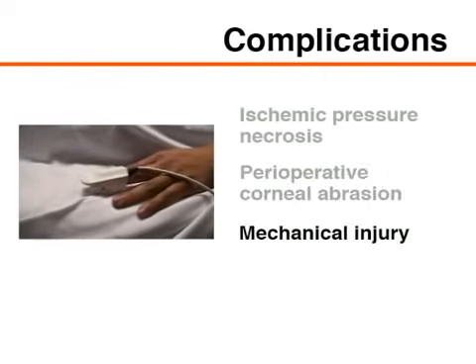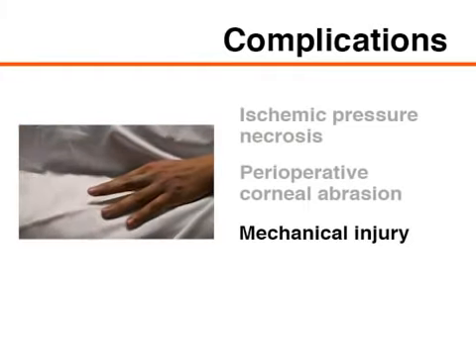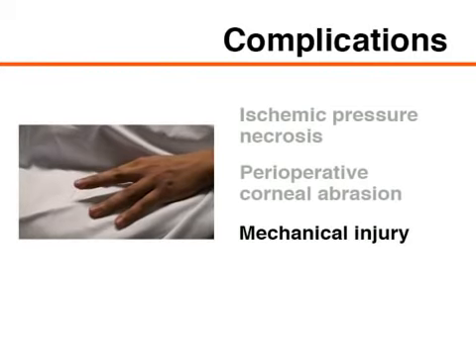Prolonged placement of a pulse oximeter probe, as may occur in patients in the ICU, may lead to mechanical injury, such as finger stiffness, making it difficult to flex the finger after removal of the probe. Although previously documented, these complications remain uncommon.